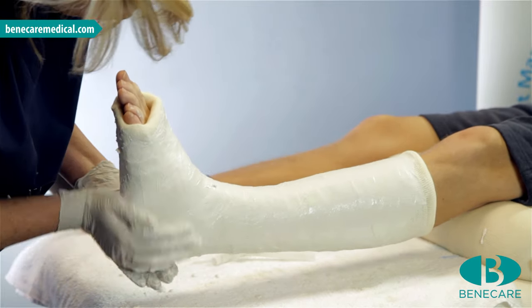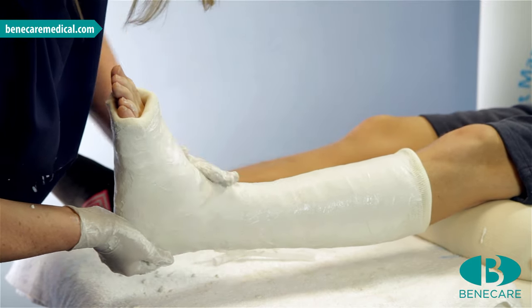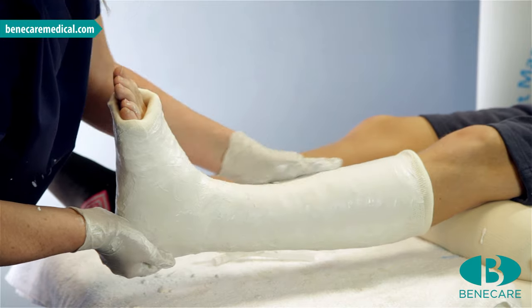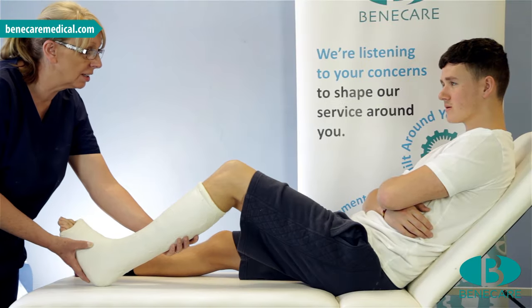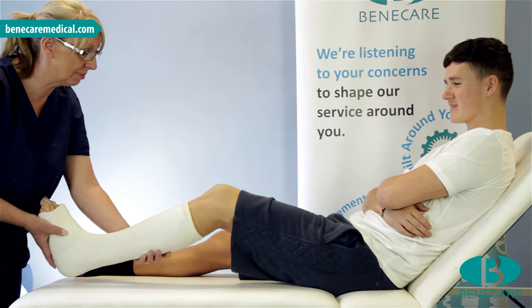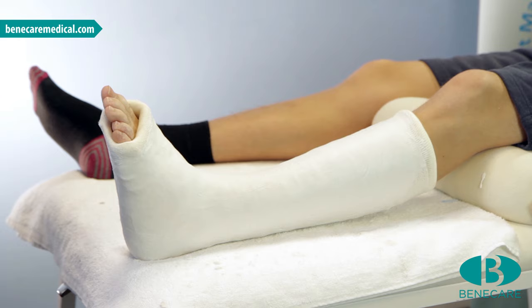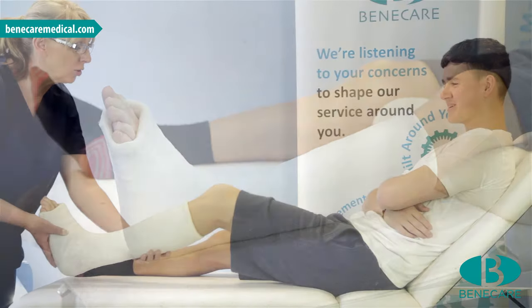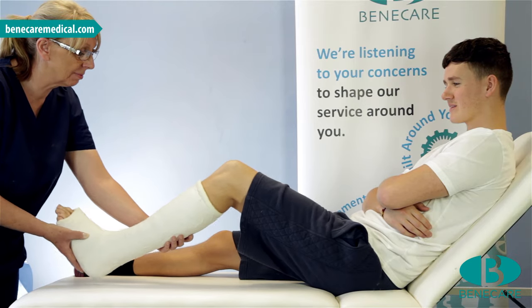Ensure the cast is smooth with good lamination throughout. Continue to mould the cast until it feels dry to touch and slightly brittle — it will sound a little hollow when tapped. Check the cast to ensure it is not causing constriction of the knee or at the toes. Rest the limb on a pillow. This type of cast can take between 24 and 48 hours to dry fully. Written and verbal cast care instructions should be provided to all patients wearing a cast.